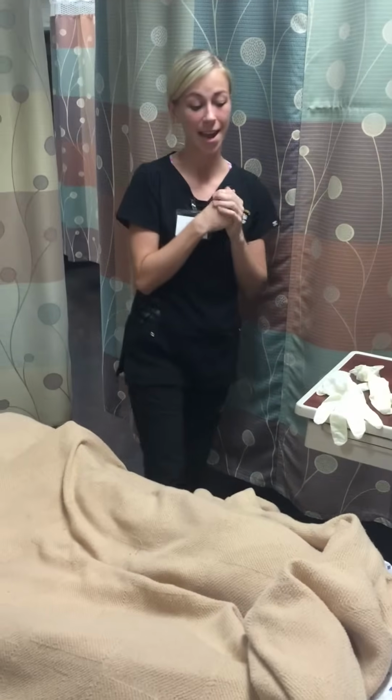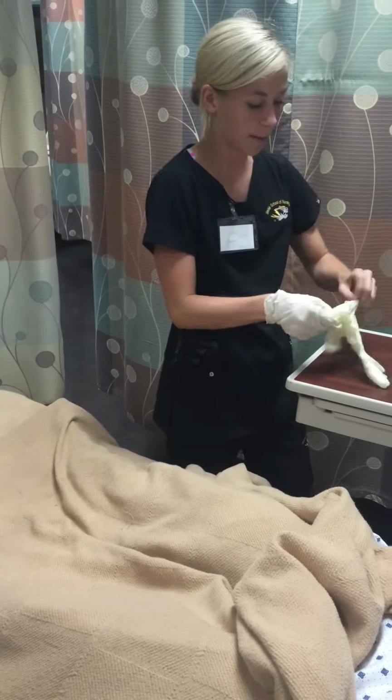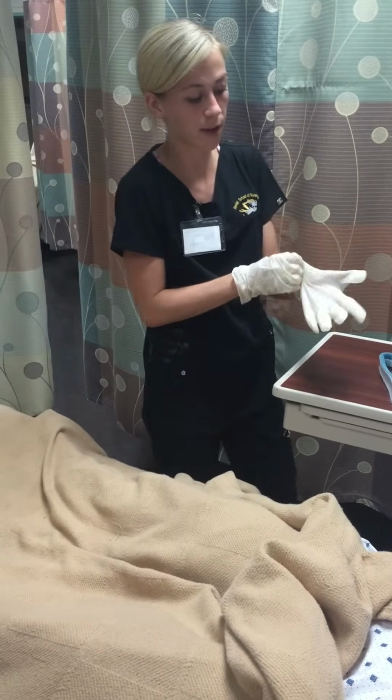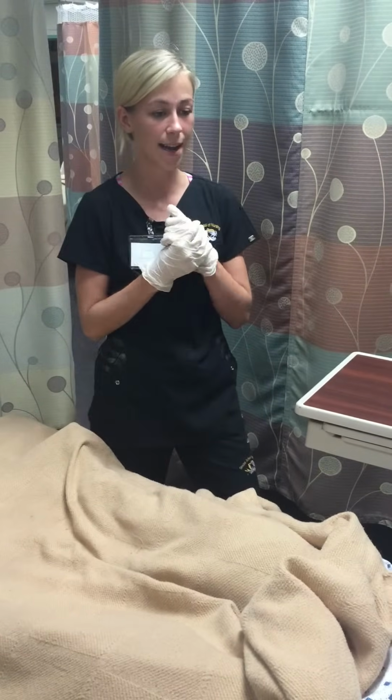Kristen. I'm going to be your nurse today. I'm here to insert a Foley catheter to help your bladder drain during surgery. Can you verify your name and date of birth for me, please? And do you have any known allergies to latex, tropical fruits, betadine, iodine, or shellfish?